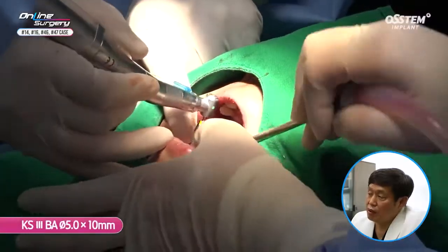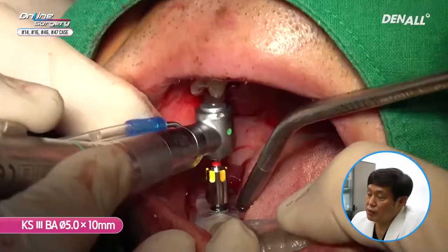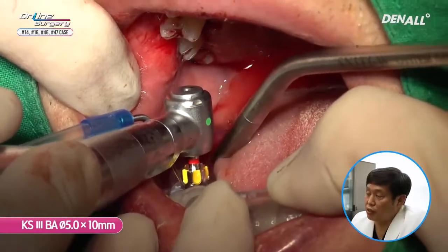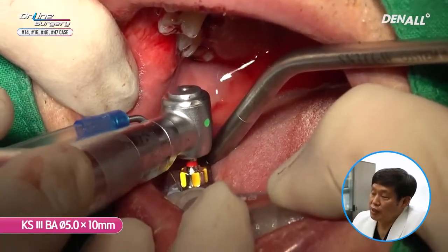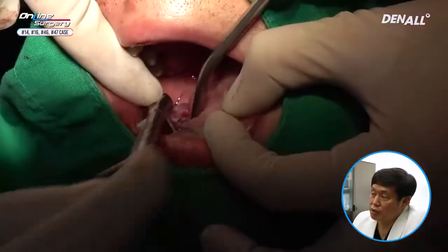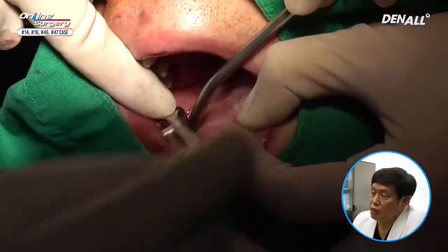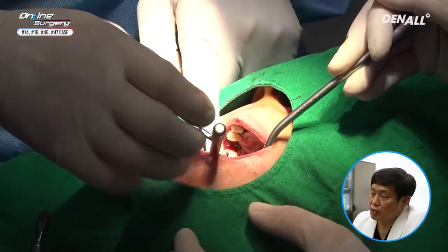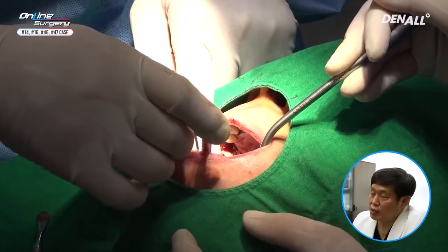New implant, a 5.0 by 10 millimeter implant, is placed approximately 80% using engine. It's going in much easier than before. The stability seems to be better than expected. Over 30 newtons, implant has been placed nicely. Final depth is adjusted.